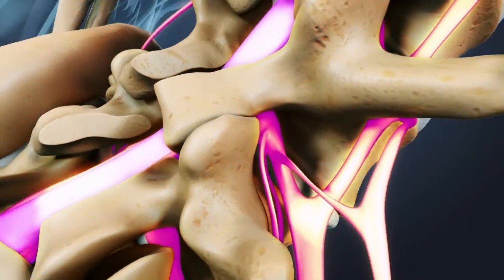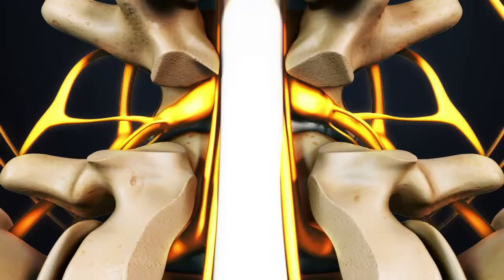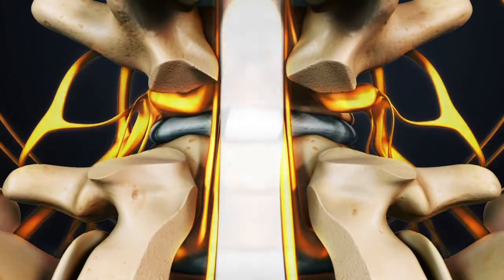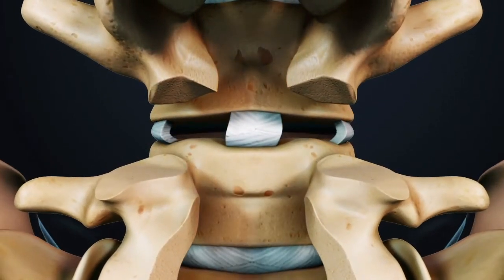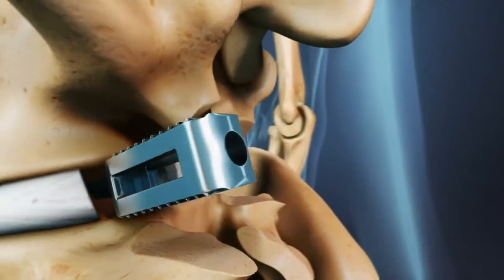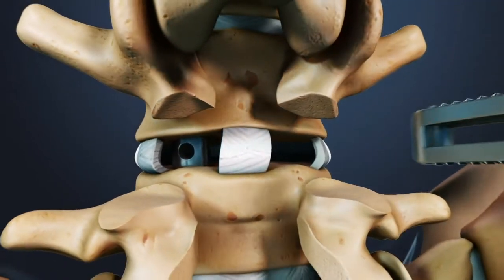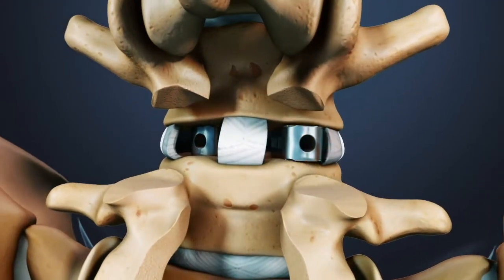The facet joints, which are directly over the nerve root, may then be trimmed to give the nerve roots more room. The nerve roots are then retracted to one side and the disc space is cleaned of the disc material. Some type of implant, called a cage, is then inserted into the disc space. The cage helps restore more of the normal spacing in between the vertebrae, alleviating pressure on the nerve roots.